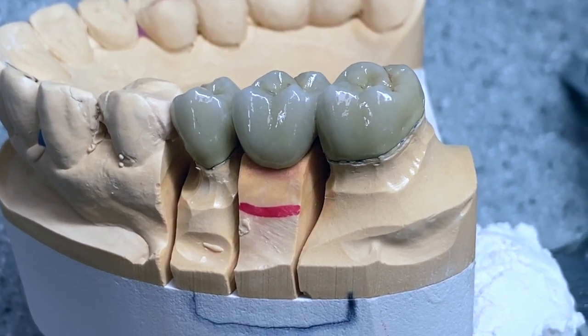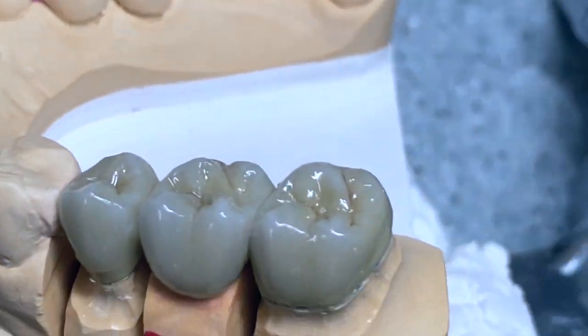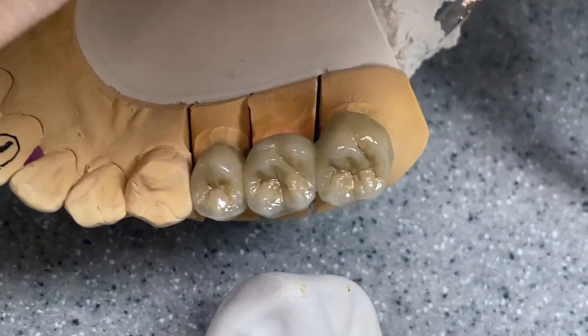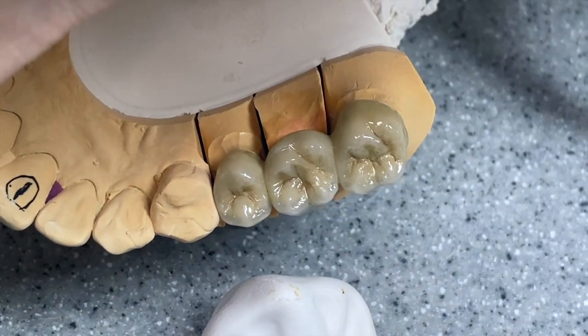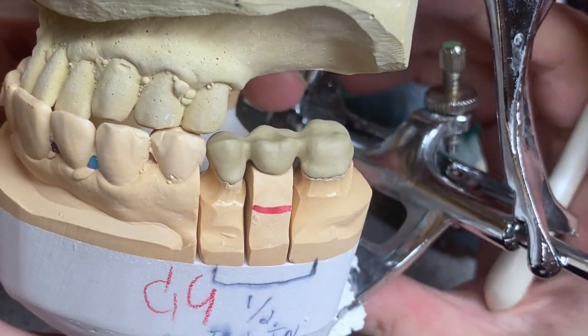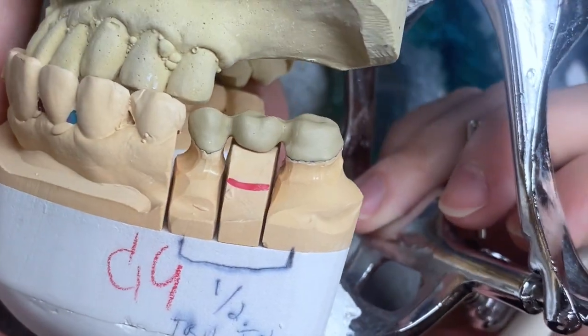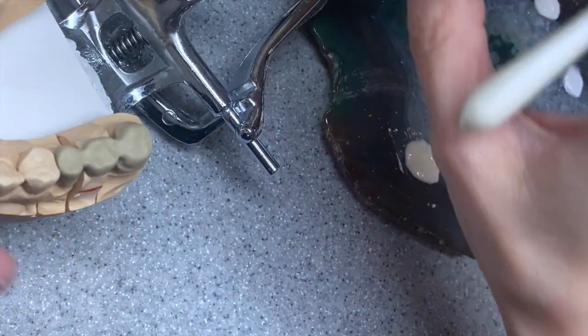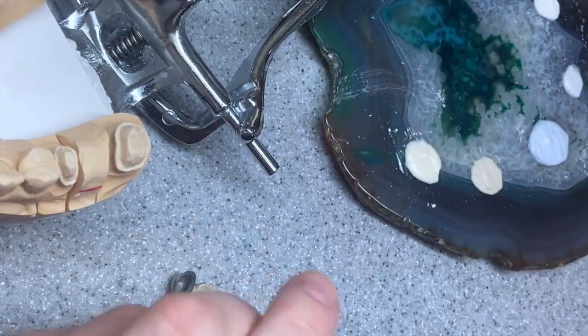Here is the bridge out of the oven — it looks pretty natural. Hello, how are you today? We're gonna build this three-unit upper bridge in shade C4.